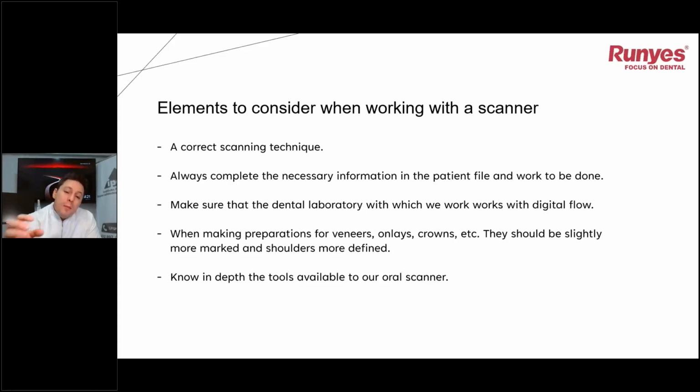Remember that the silicone doesn't care, and when you mold, it's going to push the blood out, but it's not going to be as accurate or fast. So always make sure that our preparation is very dry and, preferably, without blood on the part that we want to scan.